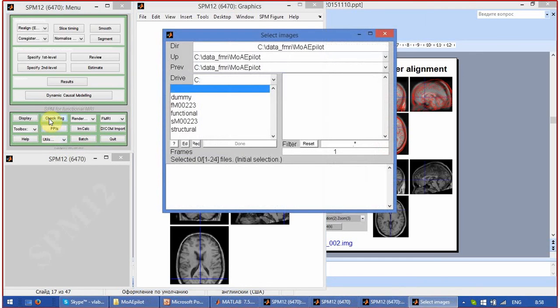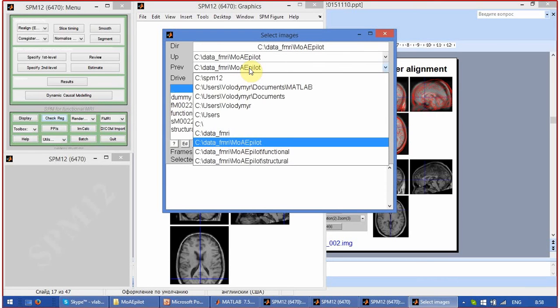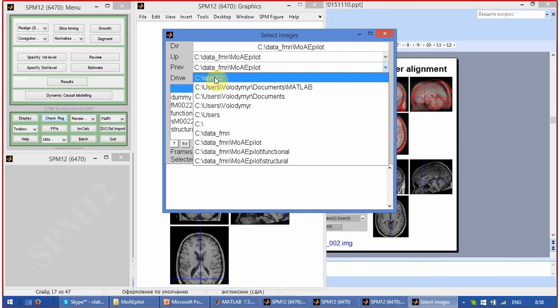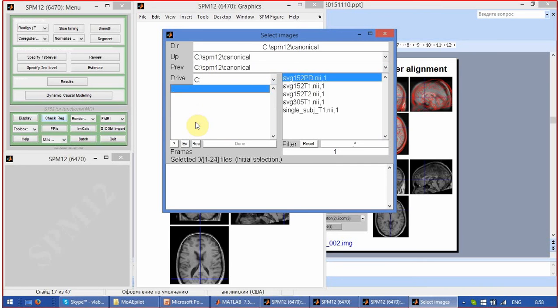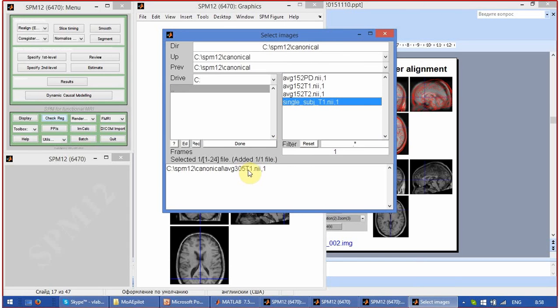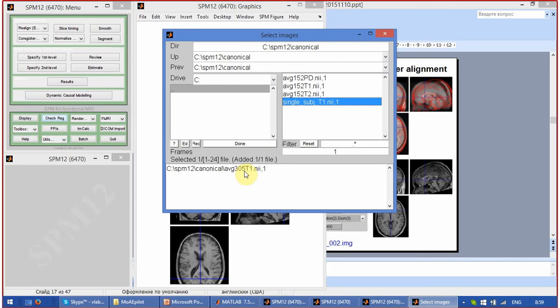Press Check Reg. In the previous menu option, you can find the folder SPM12 — go there and open the folder called 'canonical', then pick the Average 305 T1 image. That is why it doesn't look as clear — because it is the average of many individual subjects. You will see it listed as SPM12 Canonical Average 305.